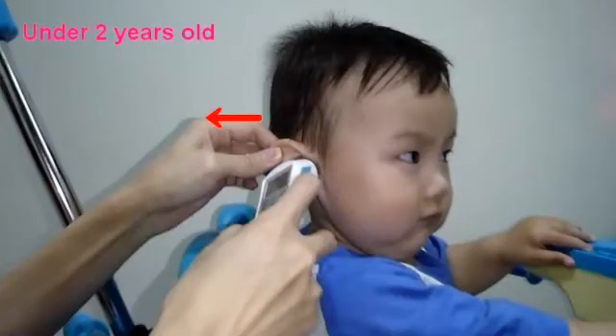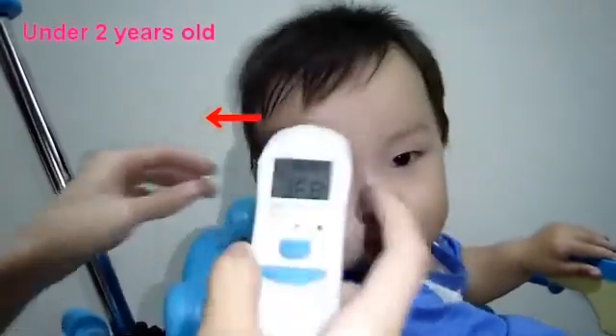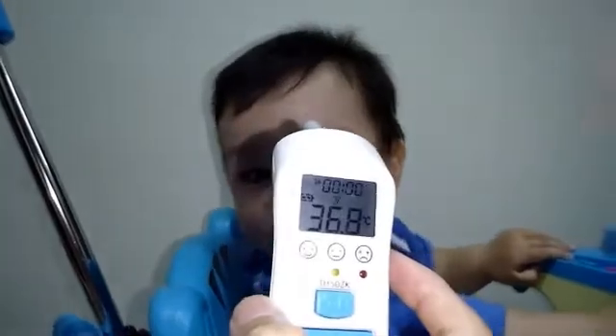For children under 2 years old: gently pull the ear straight back to straighten the ear canal, then put the probe into the ear canal.